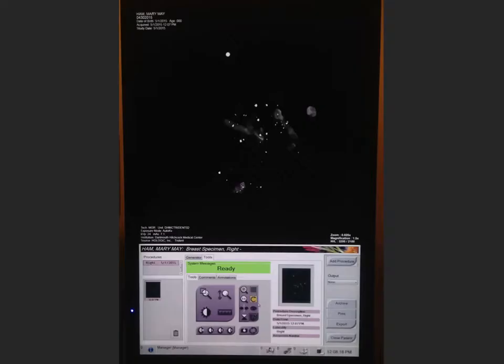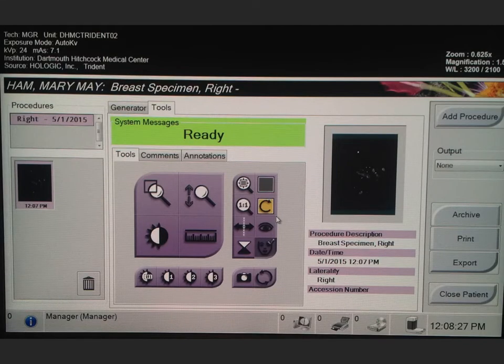Here's the specimen image that comes up. Here's what we see on the trident after the image has been taken and you can see here there's a variety of different options to be able to zoom, magnify or change the gray scale. You can also do some basic annotations and then once you're happy with the image, just select close patient and the image will print.